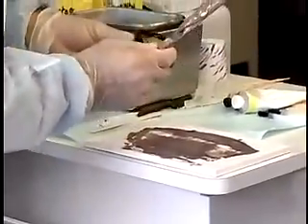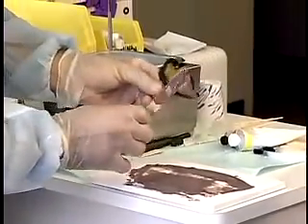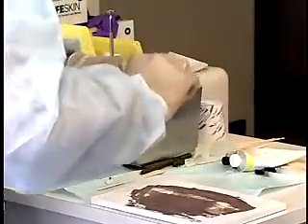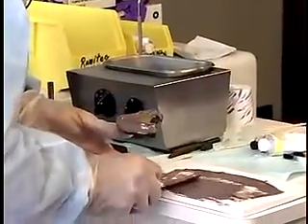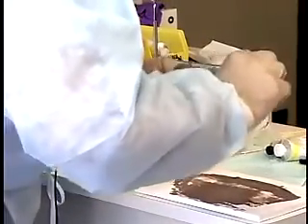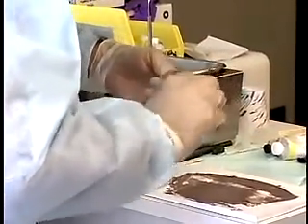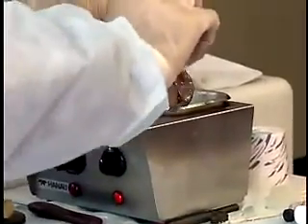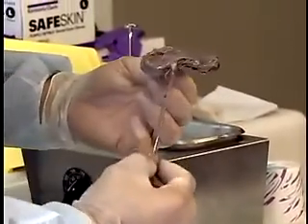Distribute the material uniformly in the tray using a small cement spatula, over the borders 2 to 3 mm onto the labial and buccal surface of the tray. Place only enough impression material in the posterior of the tray to record the tissues. Excess material will flow out of the posterior of the tray and cause the patient to gag.